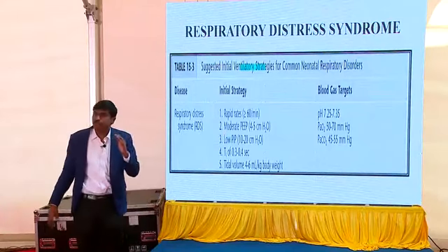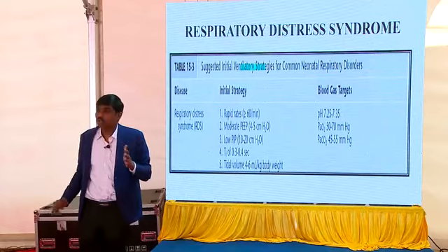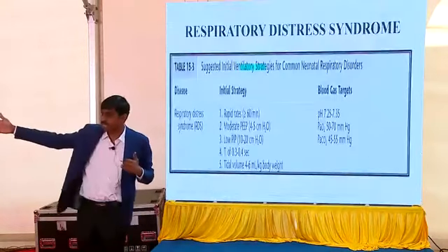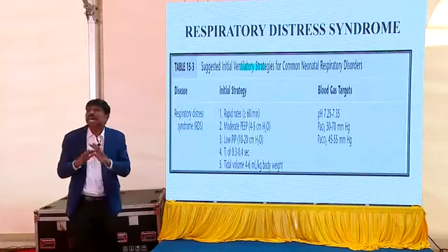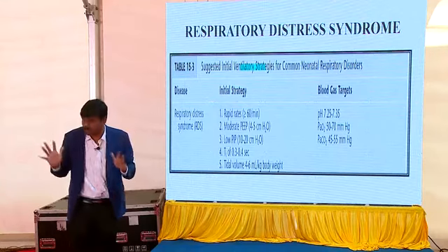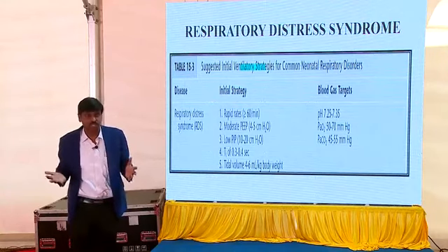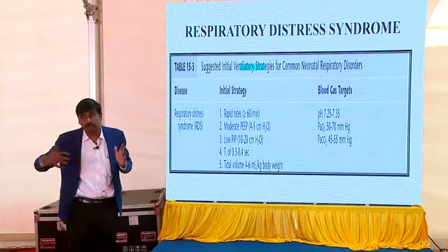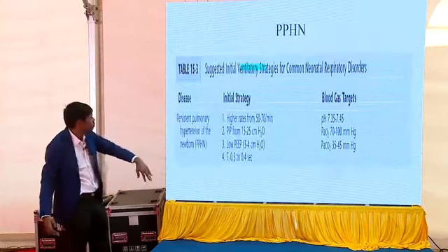Again, in a premature baby, sometimes you accept targets of 7.2 also. So you don't try to achieve high targets. Okay, so pH 7.2, PaO2 of 70. The crux is hypercarbia. You can accept carbon dioxide 55, 60 also, because in pediatrics we are targeting 35, 40. If you chase that number, you're going to bang the lung too badly, which is going to be traumatic. So rapid rates, moderate. Yeah, next one, please.